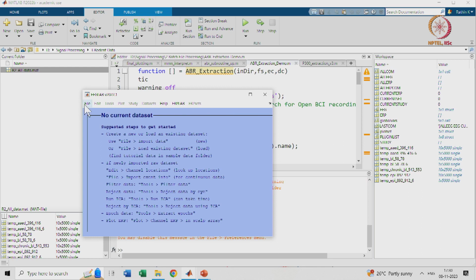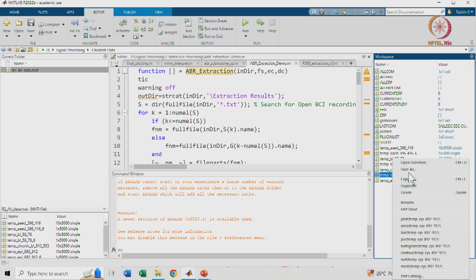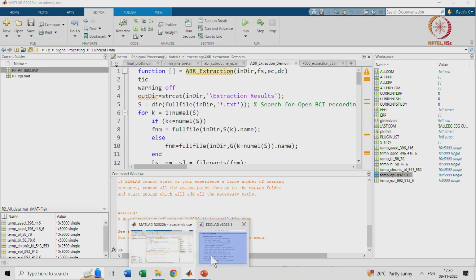Yeah, less than last time, that's good. In order to import things into EEGLAB, the data should be saved as a MAT file. So I will quickly save this. Only for the time being, I will show you one thing. This is epileptic data, so I'll just give the name rat2 epileptic data.mat file. It will be here, and now I can import that.